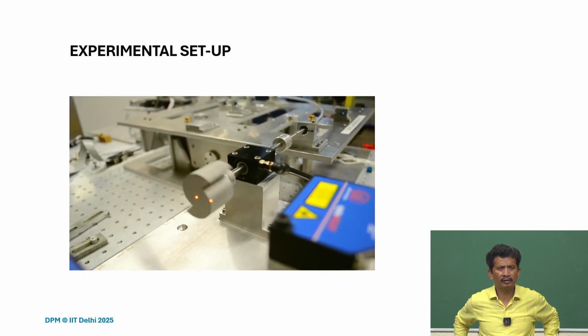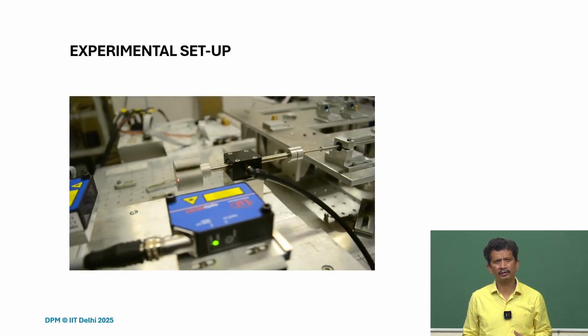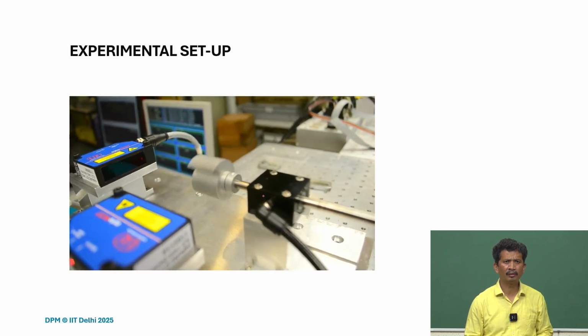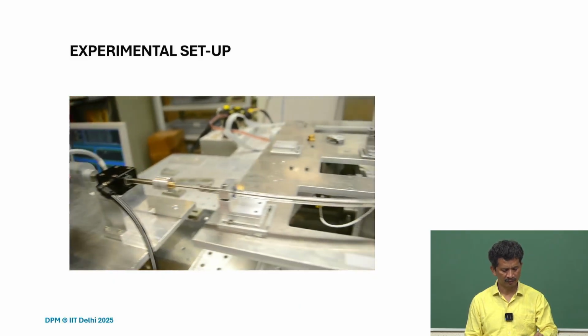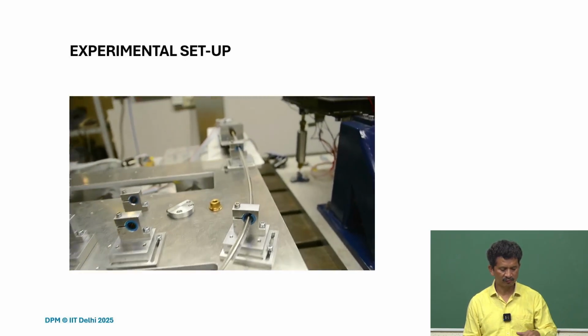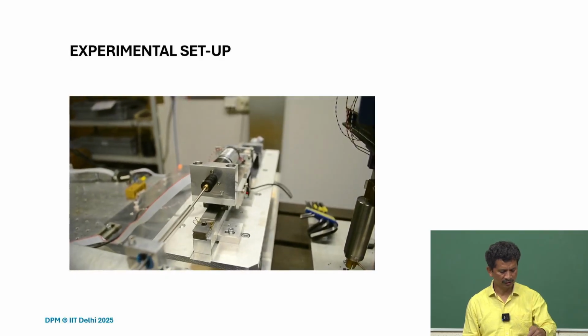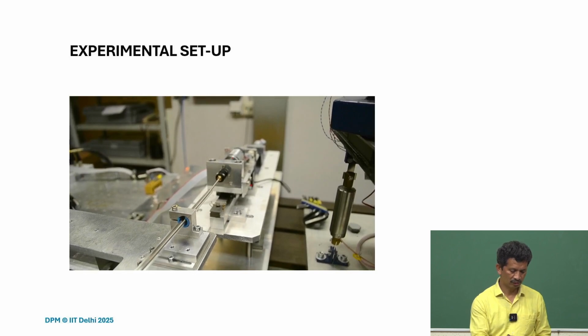So this is just one video to show. You can see the linear cam. At the same time we can measure the translation and rotation, and this is a block where you have the air bushing, so supply pressure is there, and then there is a glass tube, and the flexible instrument is passing through. This is sitting on top of the force sensing module, and what we see here at the end is the actuation module. Here you see that it was turning and also moving.